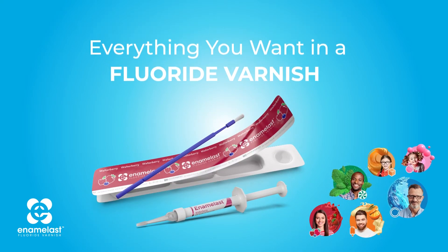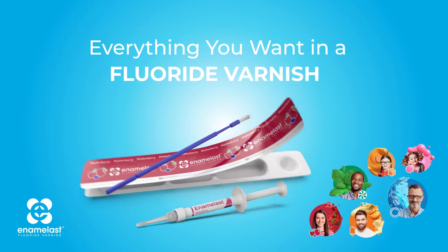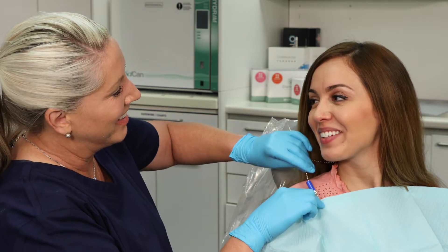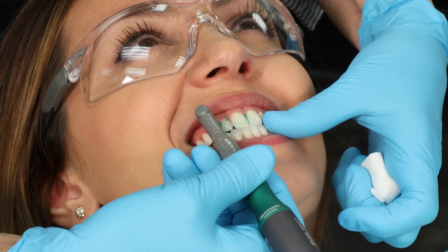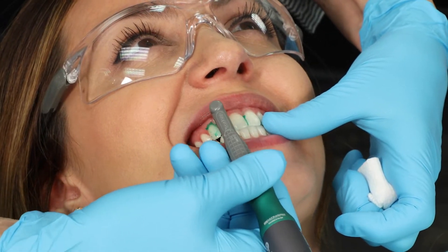Enamel Last Fluoride Varnish is available in syringe and unit dose delivery. Before applying Enamel Last Fluoride Varnish, thoroughly brush teeth, rubber cup polish, or wipe teeth with gauze.